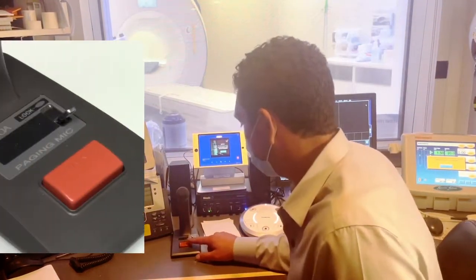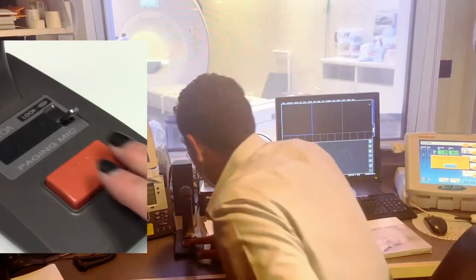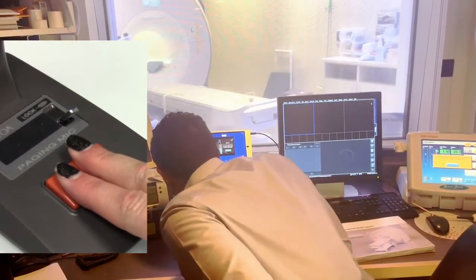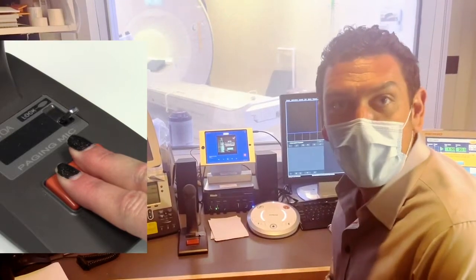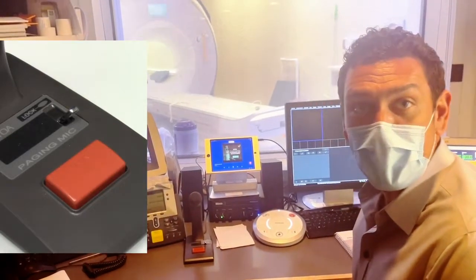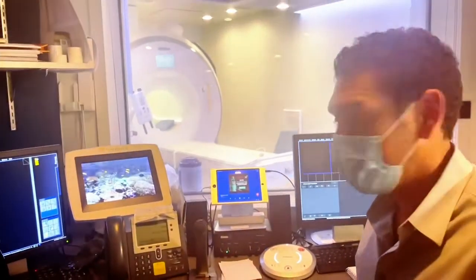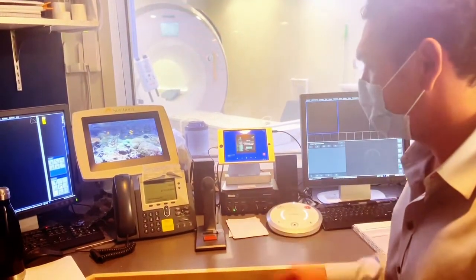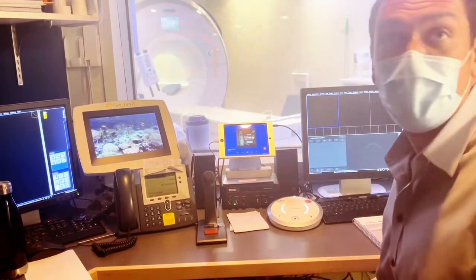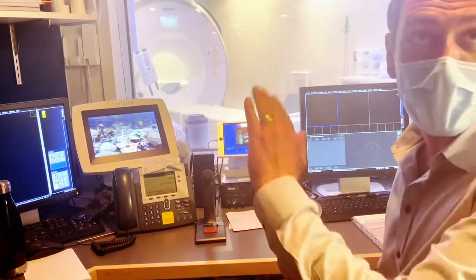To use the microphone, push the talk button and talk into the microphone. That will override the patient music. Five seconds after your finger is removed from the microphone, the music volume will come back up.